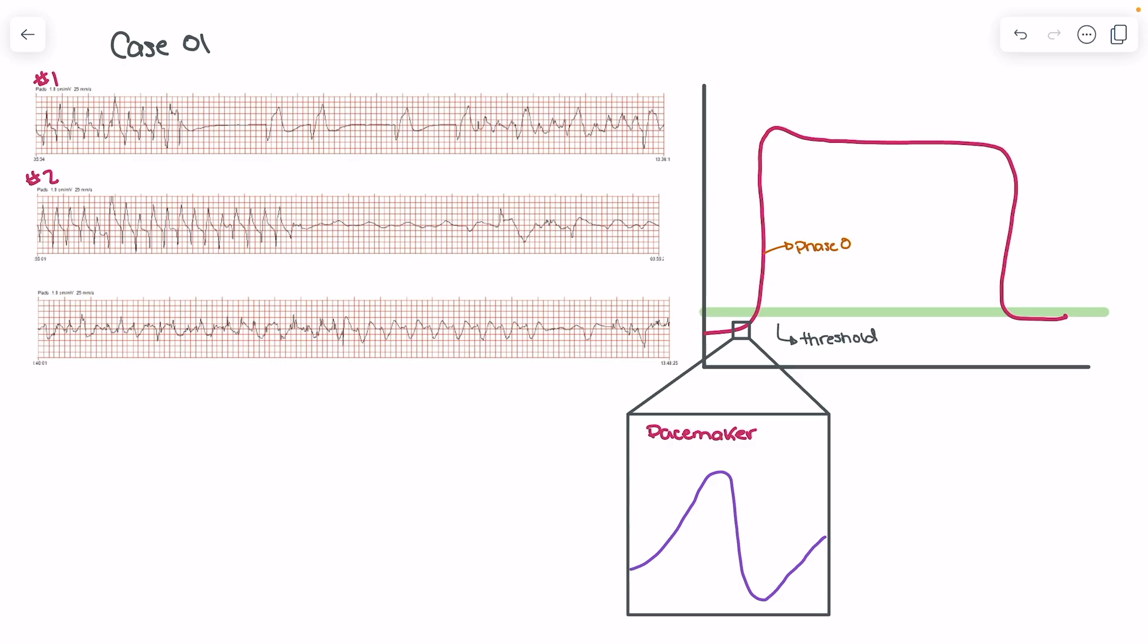What's important here is that we're seeing wide and slow complexes. And in rhythm interpretation number two, this is really predictive of hyperkalemia because we have that sine wave pattern, which is that wide, slow rhythm or the sine wave rhythm that we're seeing. So just as a recap, why are we getting that?